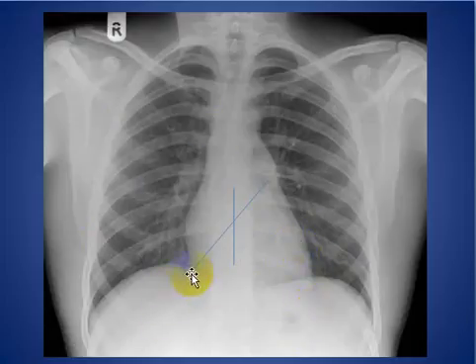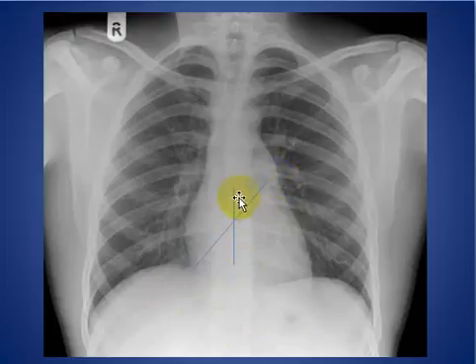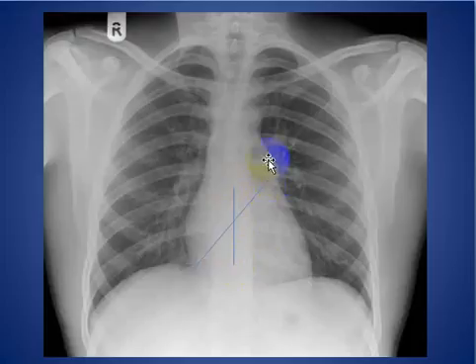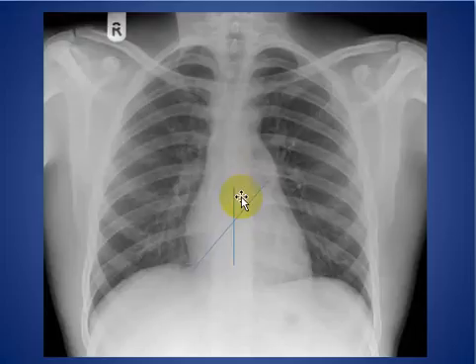First, we draw a line from the right cardiophrenic angle to the left hilum. The valve located above that line is either the aortic valve or the pulmonary valve. The valve located below this line is either the mitral valve or the tricuspid valve. Then we draw another line, vertical to the midline of the spine. The valve located in the superior aspect is the pulmonary valve, and if it is located a little bit lower, it is the aortic valve.